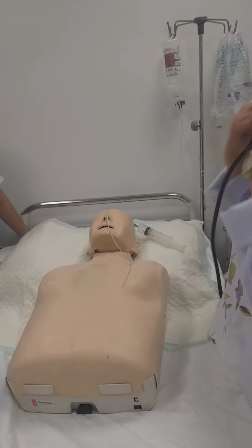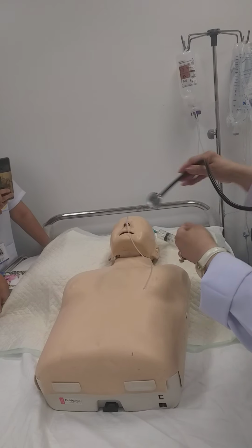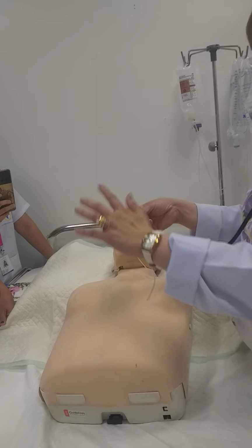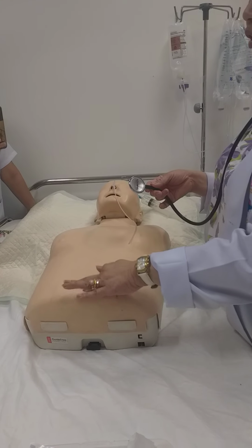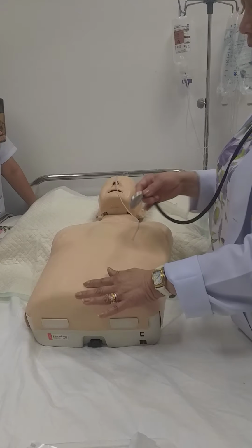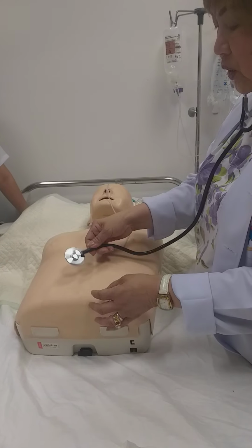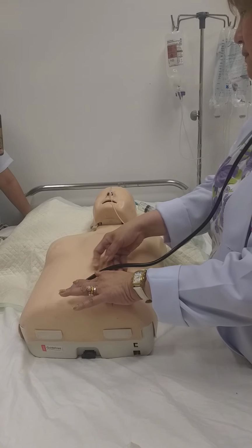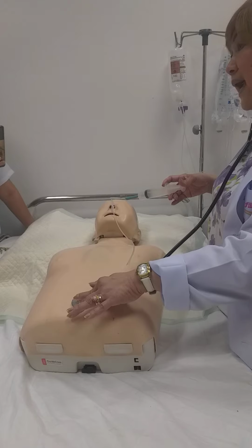Leave it for a while, set aside. Get your stethoscope. First test. Put the diaphragm. This is the navel. Okay? Yung pusod. Above or below the navel. So we will put above the navel. And push hard. Push the air harder.